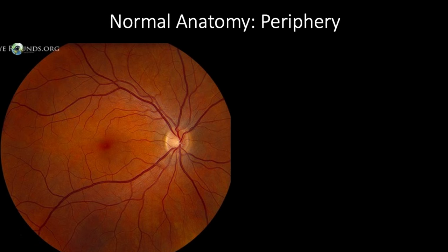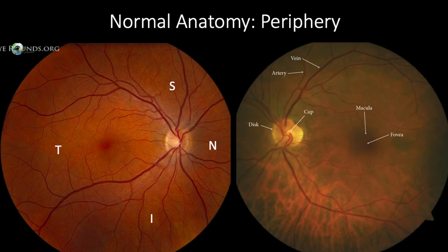Finally, we look at the periphery of the retina. The periphery is roughly broken down into four areas: superior, inferior, temporal, and nasal regions. The fundus is usually red; however, there is some variation in color depending on the amount of individual pigmentation and the visibility of the choroidal vessels beneath the retina.